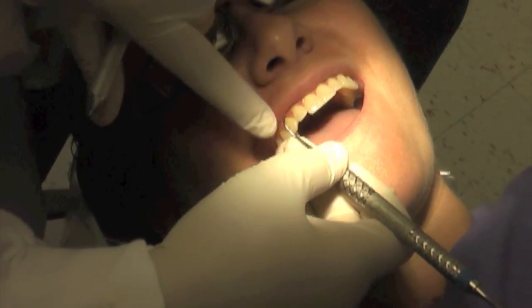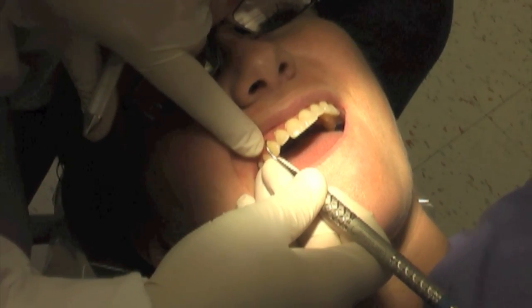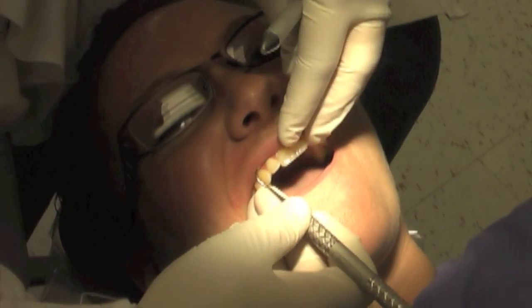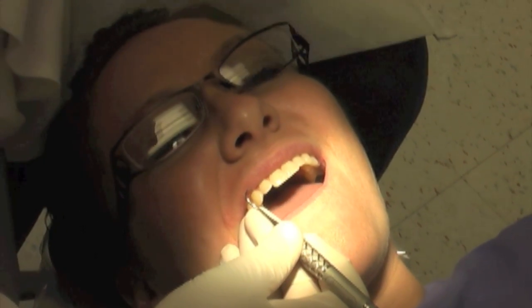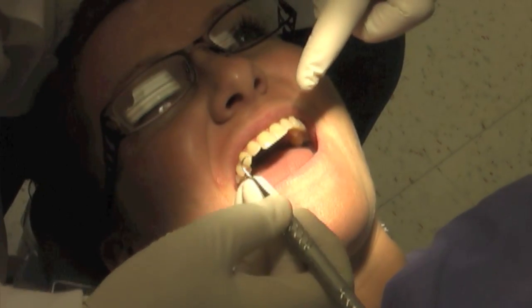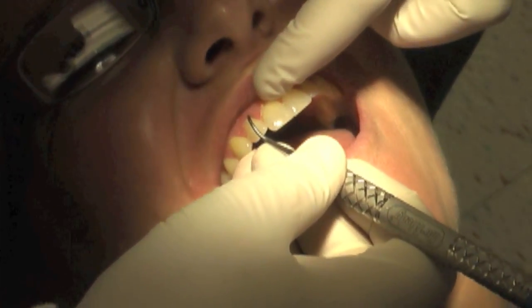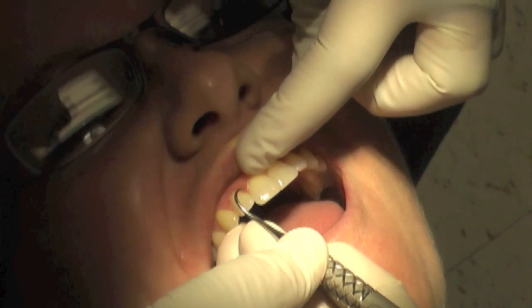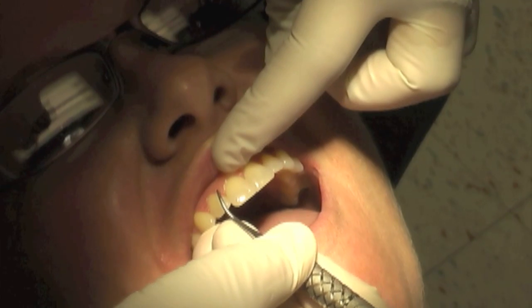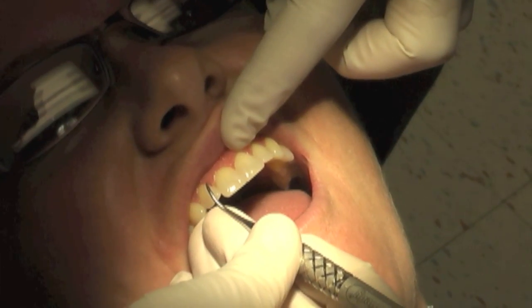My thumb is in the same neutral position. One thing that novice students do is their thumb ends up looking like this, and this isn't so bad, but it kind of limits your flexibility. With the thumb like this, you can't really do that twist like you should. And you're going to have hand fatigue quite quickly if you keep your thumb like this — that's the main reason we don't like it. But you need to do that little twist. I always kind of tease and say: twerk toward the toe, move toward the toe and twist and twist. A lot of times students forget that twist — they just kind of move in, and that doesn't keep the toe against the tooth. If you don't twist, your toe is going to be out in the gingiva. The twist also helps make the blade grip into the side of the tooth and against the deposit. So if your thumb is like this, you're not able to do that twist.